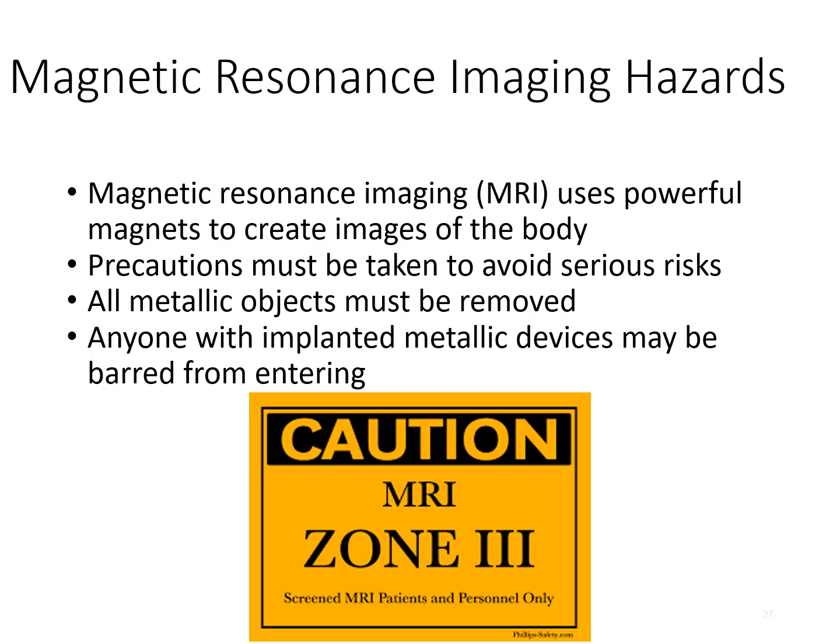But the MRI does use powerful magnets to create images of the body. Precautions need to be taken to avoid serious risk. All metallic objects need to be removed, and anyone with an implanted metallic device may be barred from entering.